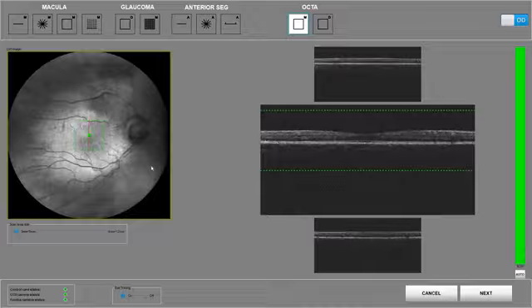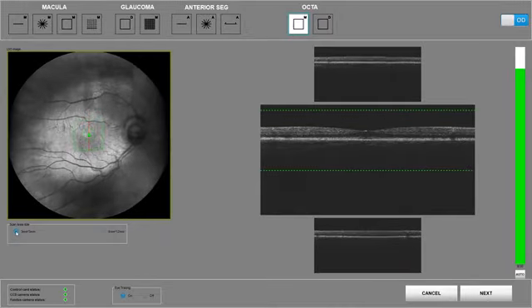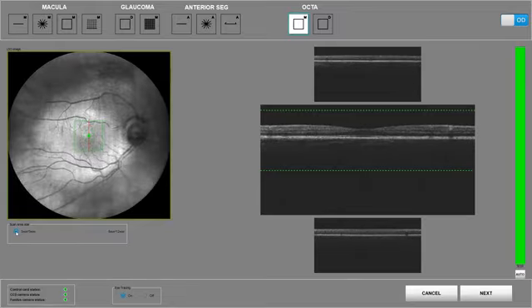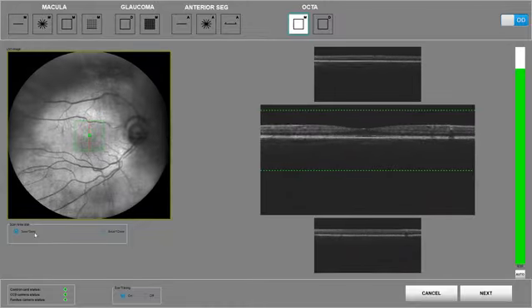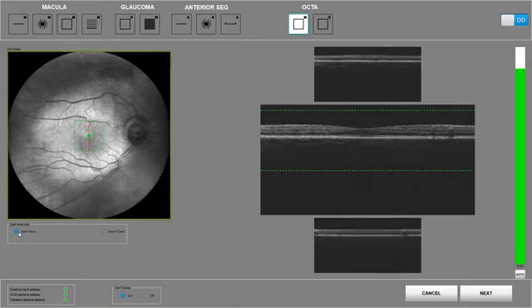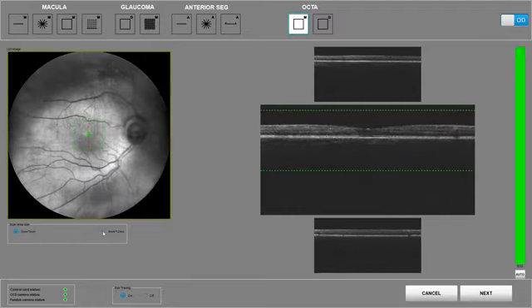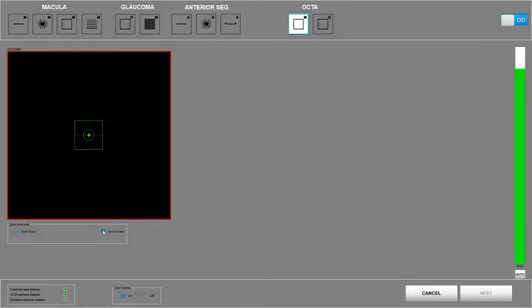You can select among the 3 by 3 millimeters area, and if you select this, all the information you're going to have is going to be very detailed. So we are using this mode for very detailed areas in case we want to assess very strictly a pathological area.